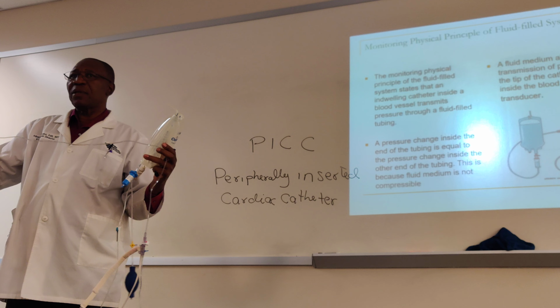So you're going to see everything, all the pressures, all right? Depending on the type of intravascular catheter that you have, okay? If you only put in an A line, you're only going to be seeing the blood pressure, the arterial pressure. But if you put in a Swan-Ganz catheter, we're still going to go over that, you see a lot of hemodynamic pressures like the ones that we went over yesterday, okay?